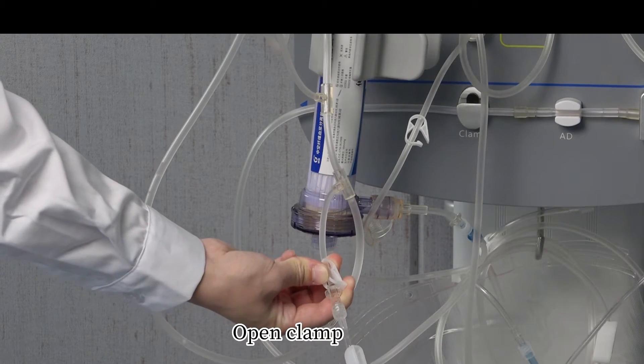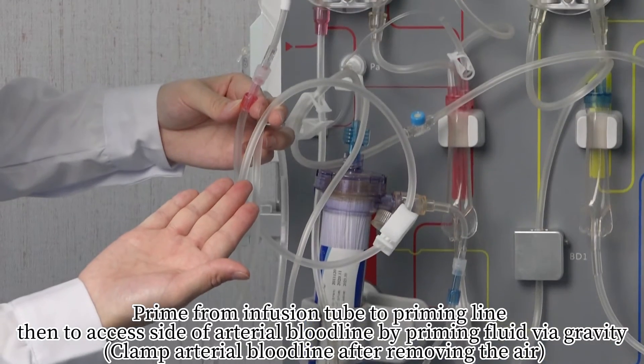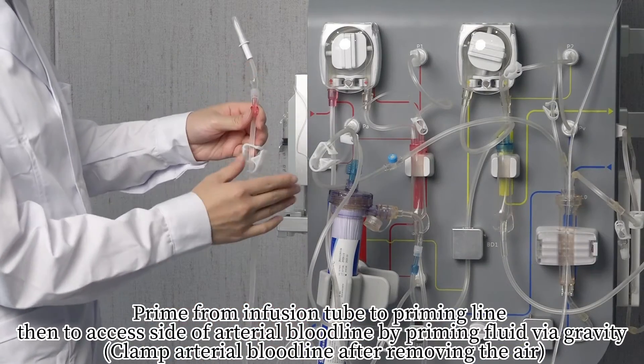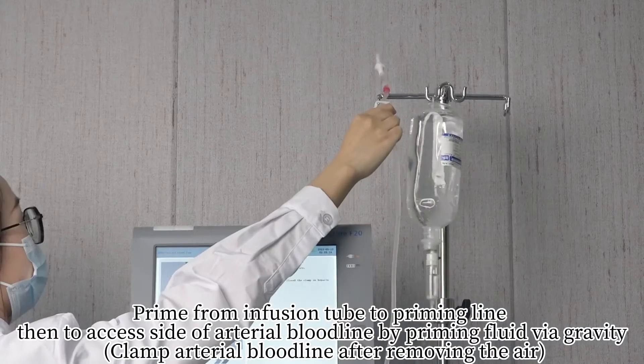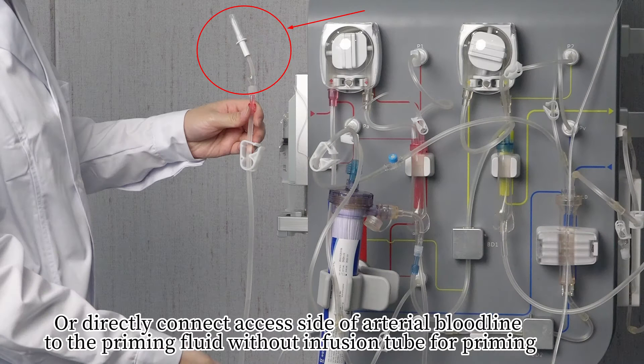Open the clamp. Prime from the infusion tube to the priming line, then to the excess side of the arterial bloodline using priming fluid via gravity. Clamp the arterial bloodline after removing the air. Alternatively, directly connect the excess side of the arterial bloodline to the priming fluid without the infusion tube.